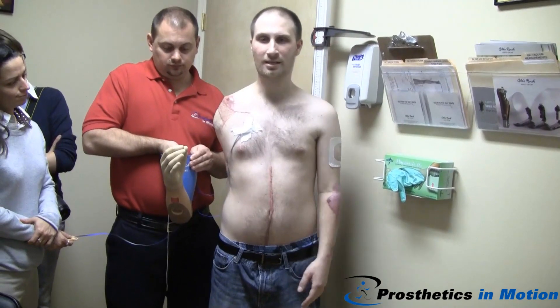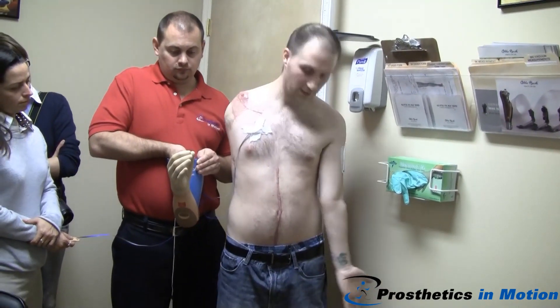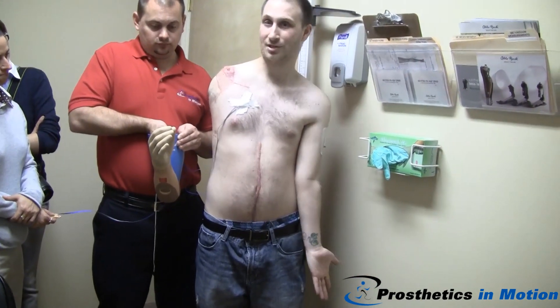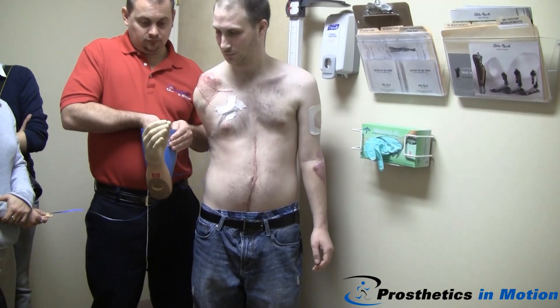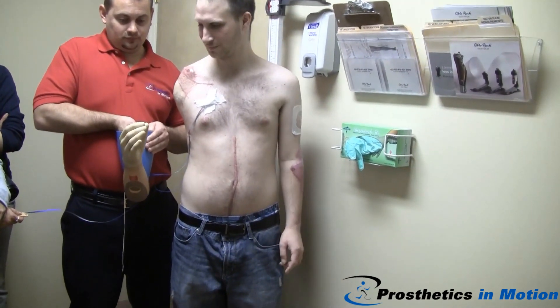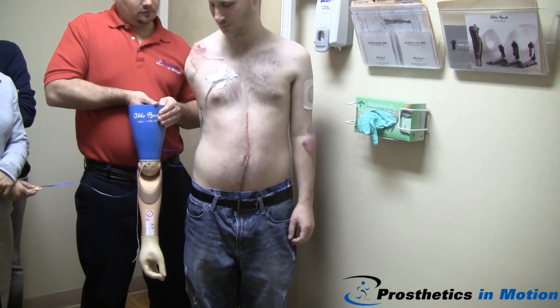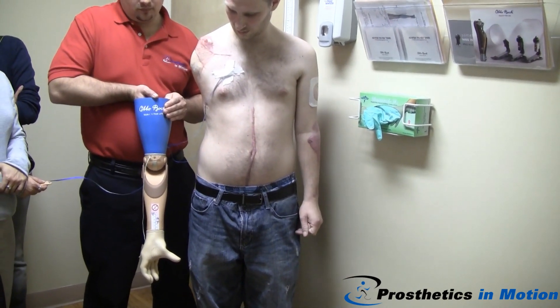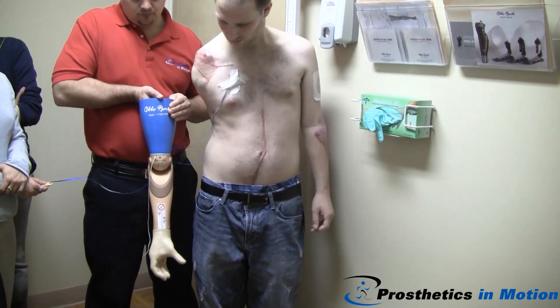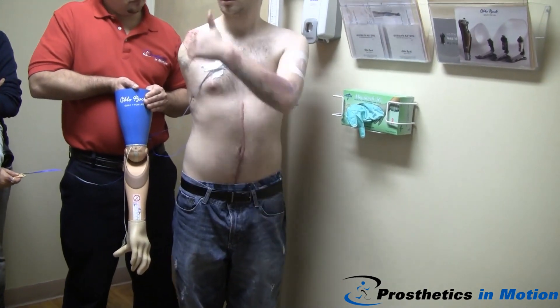I'm going to have my arm down by my side with the hand open all the way. Let's turn it around so it's facing away from my body. So we are in the hand — I'm going to open it right now. By squeezing my back muscle and now opening the hand — it's done already. Now I'm going to turn it around. That was pretty cool, and I did what I said I was going to do.